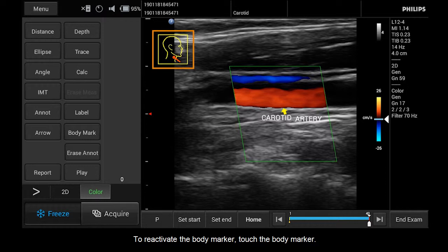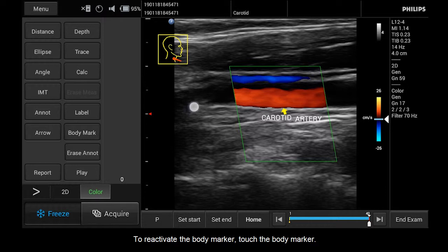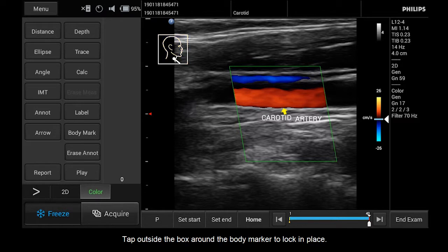To reactivate the body marker, touch the body marker. Tap outside the box around the body marker to lock it in place.